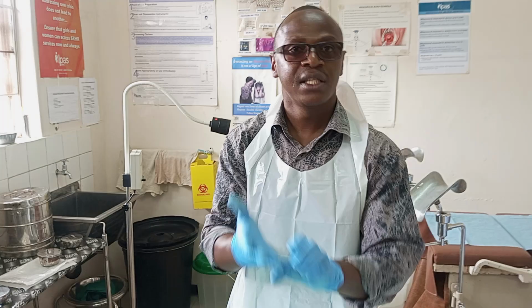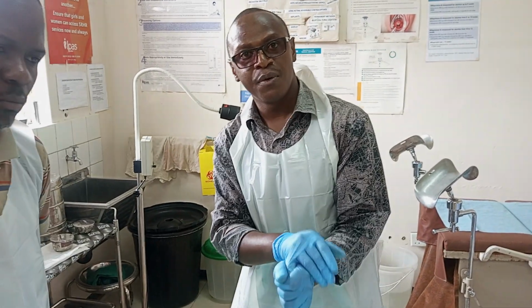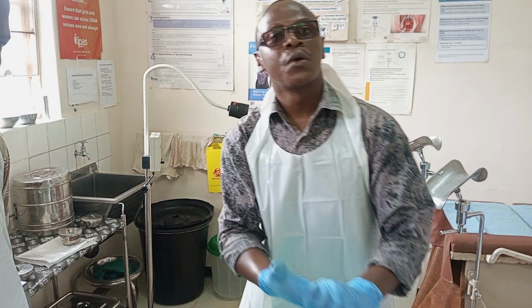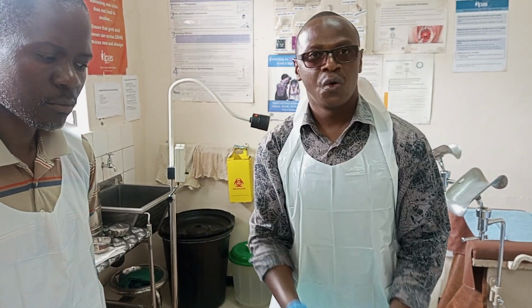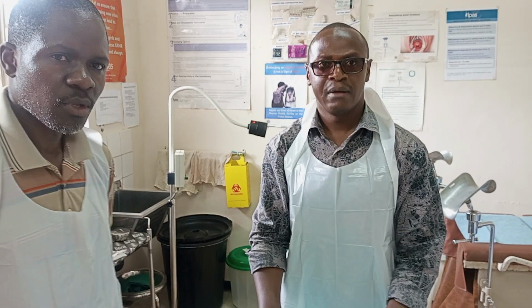So I think I've mentioned management of incomplete abortion, evacuation of RPOCs, missed abortion, induction of abortion, TOP, termination of pregnancy. Then you can also use it for collection of endometrial biopsy and also molar pregnancy. About 5 indications so far.